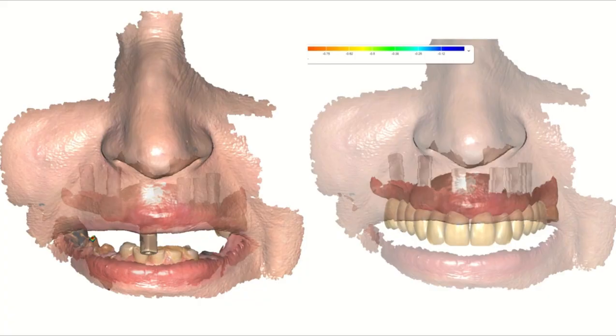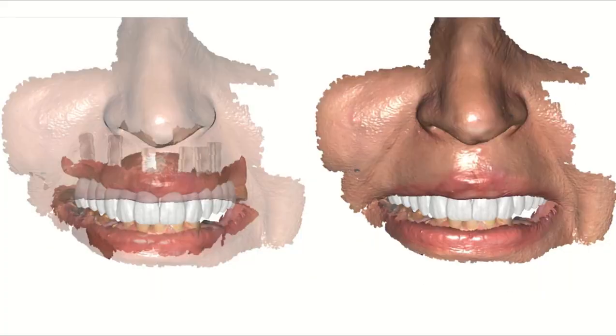Here is the prosthetic part. In my opinion, intraoral scanner will make your prosthetic part very easy. No more nightmares in the implant prosthetic phase. All you need is an excellent, accurate intraoral scanner that can capture soft tissue well, especially in the lower arch. Of course, lower arch scanning is completely different than the upper arch, especially in the full arch cases.